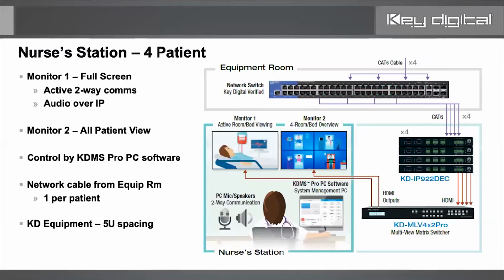Okay, so from the perspective of the nursing station, this gets into our equipment. By the way, Leon, just wanted to chime in. The camera specification is a minimum illumination of 0.1 lux, which is equivalent to full moon lighting.